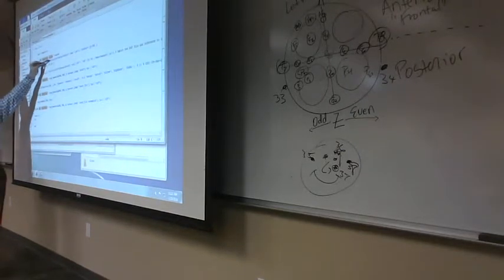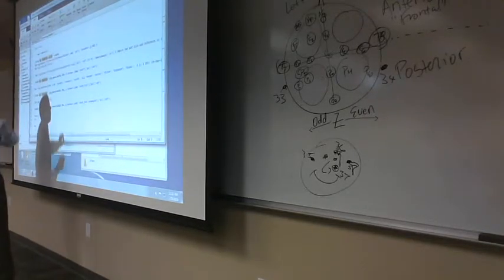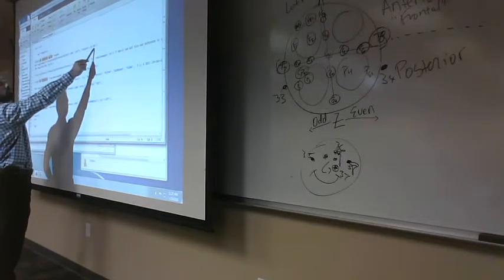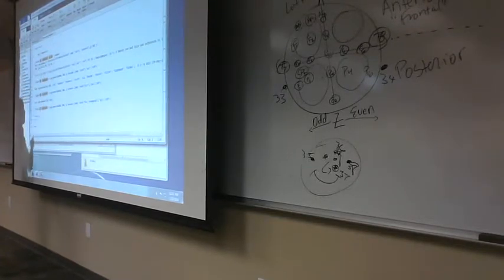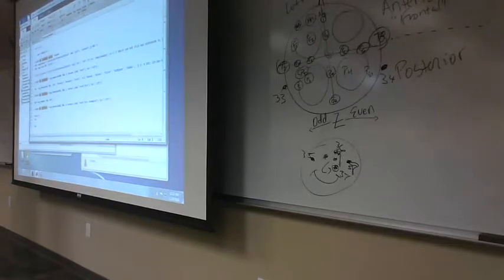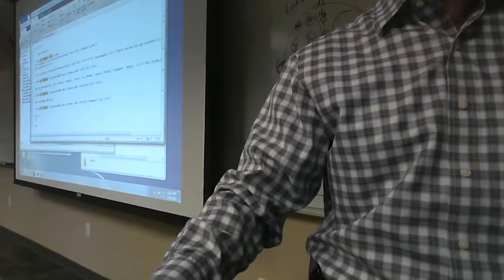We input our same information. Now what it's doing here is first it's actually just reading the channels in, all 1 through 40. But then it'll do another step to re-reference them to 33 and 34 as a separate step. So we'll see if that works. Why don't I try it first, and if it works, then you guys can dial it in. So I'm going to do this.